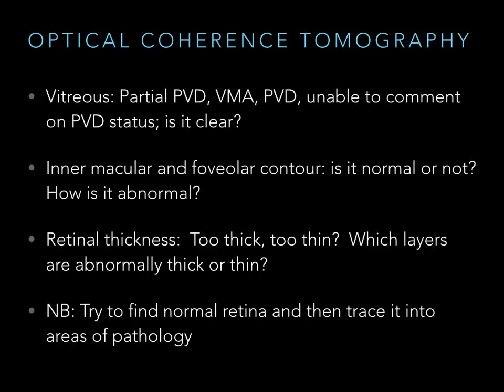I could give a whole lecture on vitreomacular abnormalities, but we're not going to. Suffice it to say, it's very important. This is one of the most revolutionary parts of OCT, being able to see the vitreomacular interface in a way we've never seen it before.